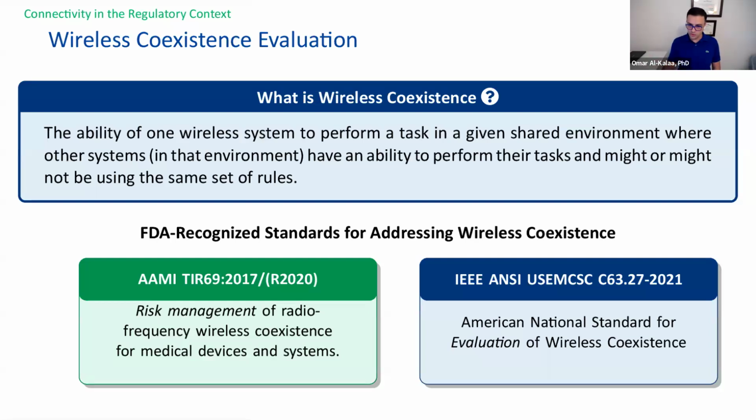So your device should not be interfering with and preventing other devices from operating on that spectrum. And those other devices you have no control over. So if your device is using Bluetooth, you can't ask others not to use Wi-Fi. You just simply can't, unless you have a strictly controlled environment with shielding and access rules. And that is very, very rare.